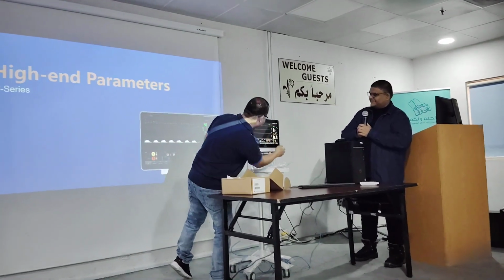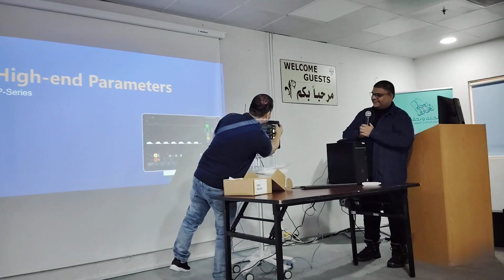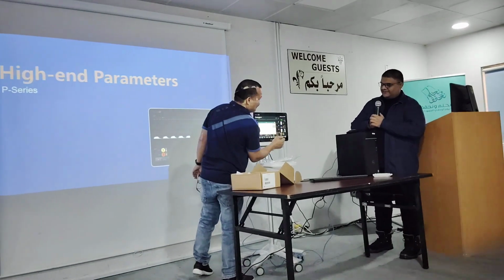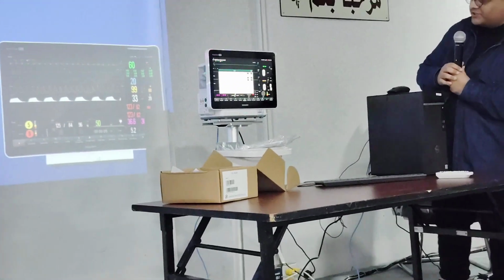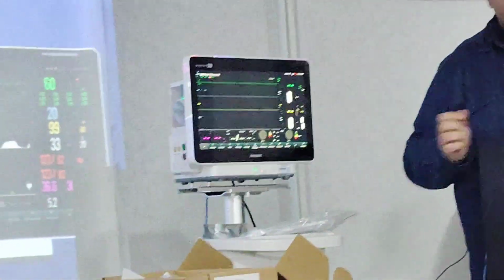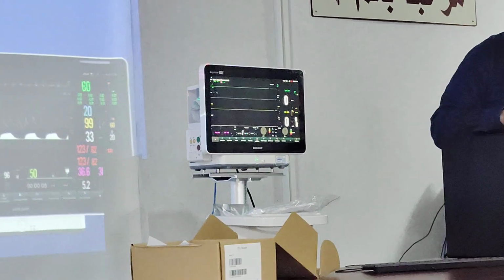Yeah, click on the corner speakers. Just touch the speaker logo in the corner. Okay, you want to show us? Come over here. There is a monitor on. Just touch this one. Yeah, then you can adjust volume. Yeah. Plus and minus. That's nice, right? With the logo. Okay, thank you very much. So, do you think it's easy to adjust the volume like this? Yeah. It's fairly easy, it's not very hard. But we have a better way actually.